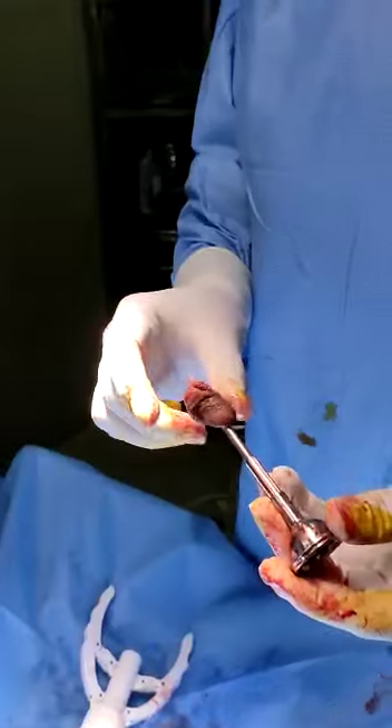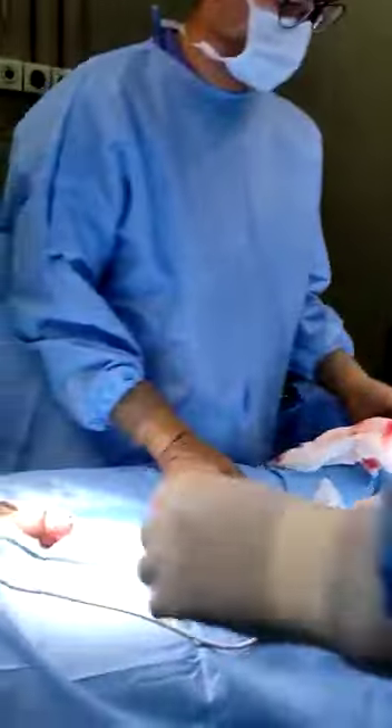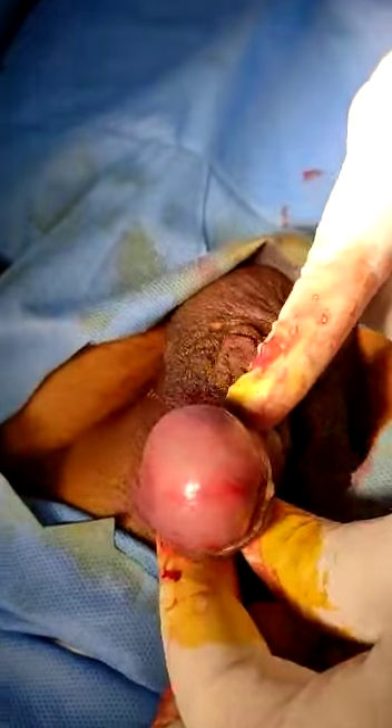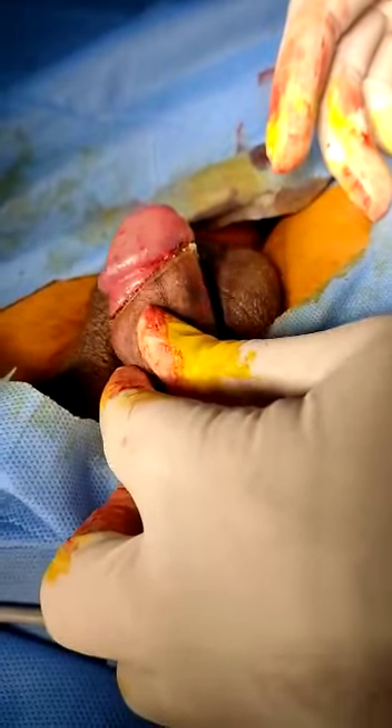This is the ring — this is the skin which is removed. And if you see here, it is absolutely bloodless. You can see the ring here; there is a silicone ring and there is no bleeding whatsoever. The edema is mainly because of the local anesthesia we have used.